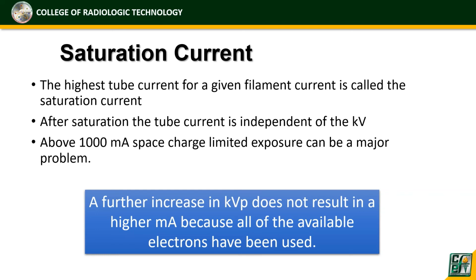And therefore, kung siya ay space charge limited exposure, it can be a major problem because the electrons will not be able to move from the cathode side towards the anode side. So, yun yung space charge effect.